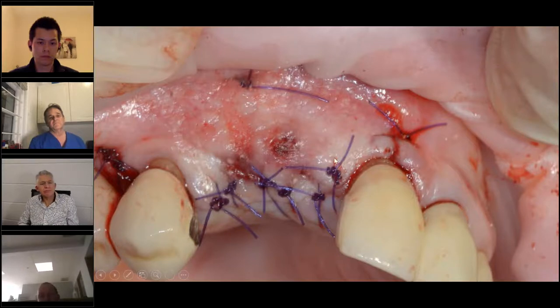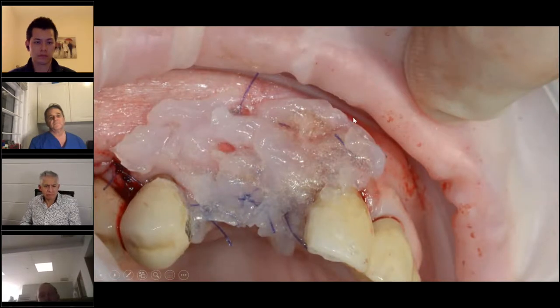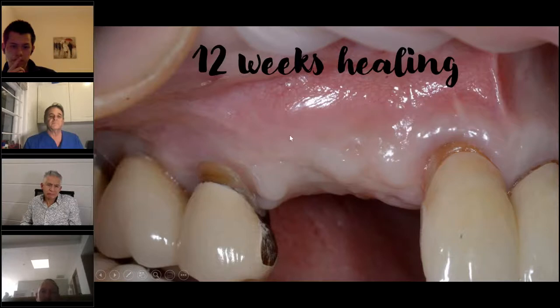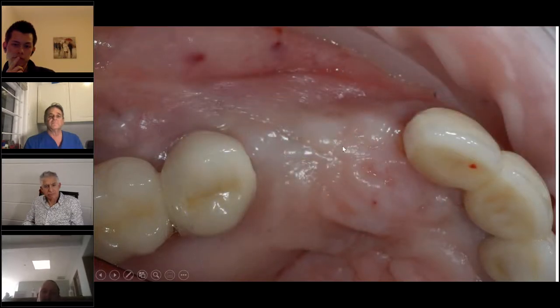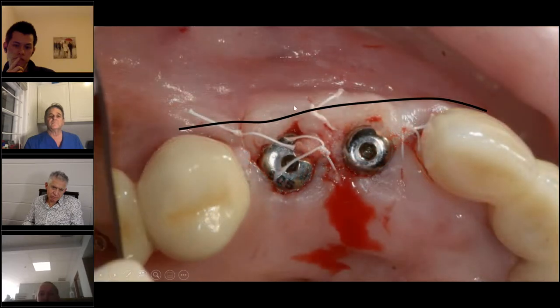And we can also see the normal sutures around here. And I also started to use the Blue M oxygen gel, and we just wait for oxygenation. And this is the patient after 12 weeks of healing. You can actually see that it's just so lovely, this soft tissue. And the gain, we have a massive gain here. From this situation to this. So I'm very happy. And we make a double omega flap, I call this, just to push everything outside. So actually we can gain a little bit more soft tissue in this area. Just a simple technique.